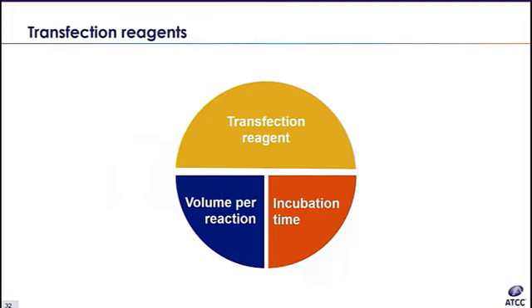So regarding transfection reagents, there are three main areas of concern. First, which lipid should I use? That would depend on the cell type you're using and the cell characteristics. As I just mentioned, certain lipids are generally geared towards cell suspension, like ATCC's Gen X+. Other considerations involve what you are trying to deliver to the cells. Certain lipids are for DNA, others may be designed to work with RNA or small proteins.